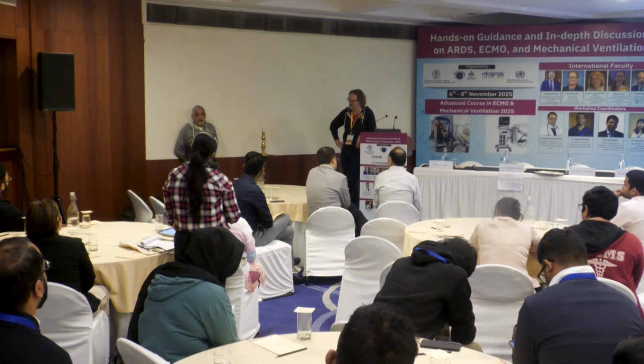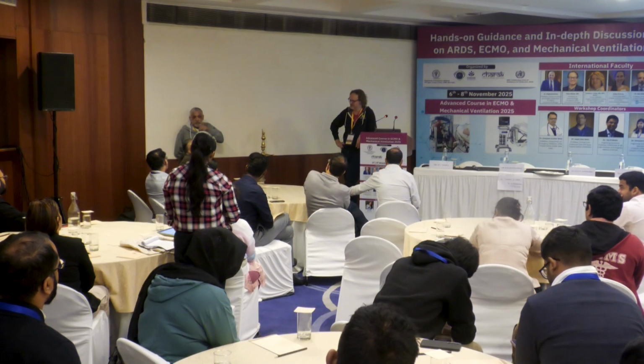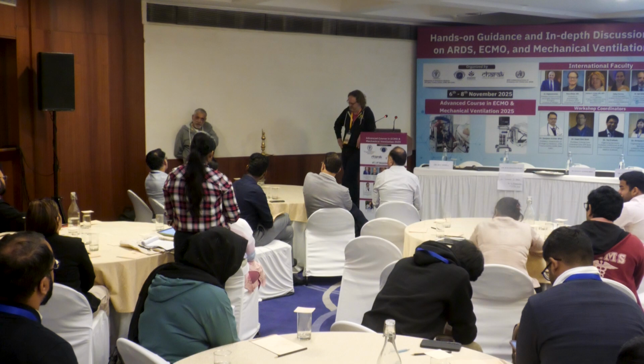When we are doing it in the cardiac unit, the big challenge with the dual-lumen cannula is this: you put the guide wire in, and first of all, the guide wire will keep going towards the pulmonary artery. Somehow you have to figure out where the opening will be, and then it will come straight down.